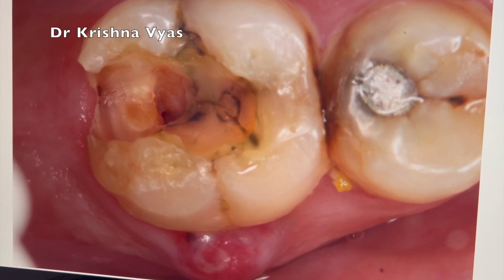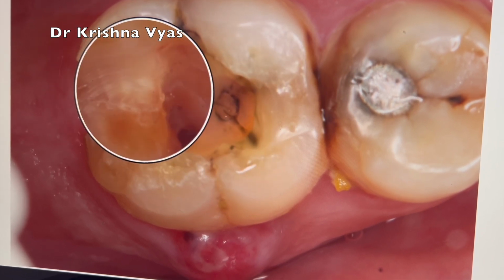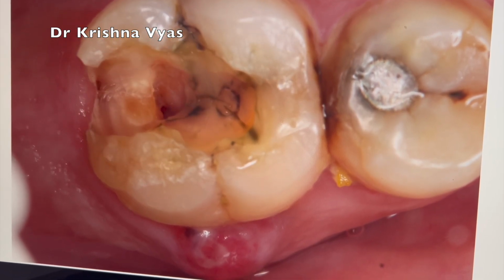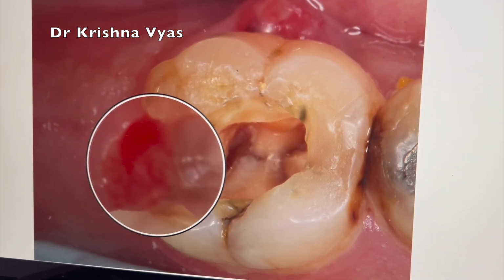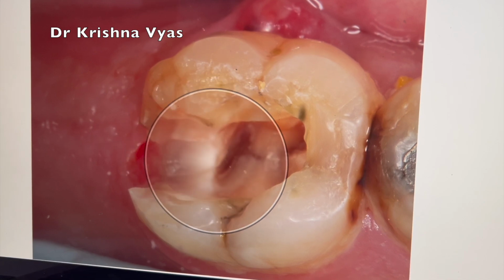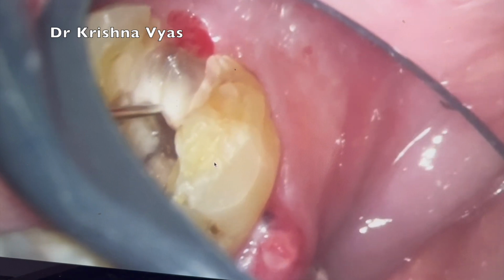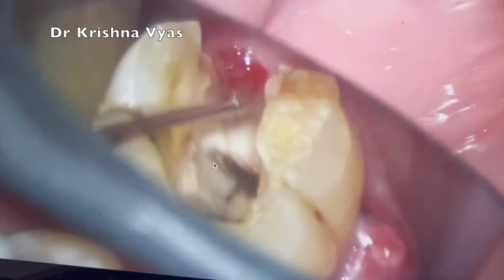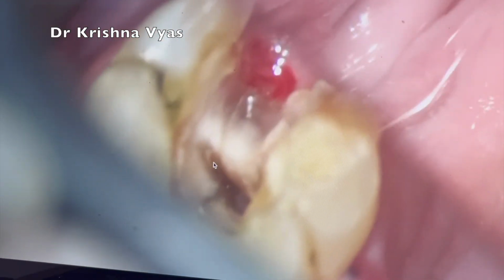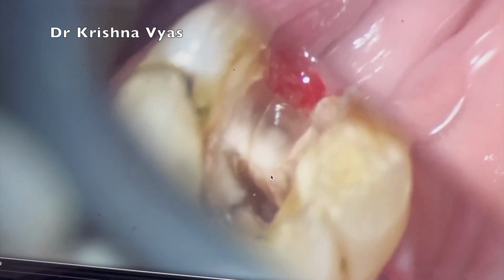So mentally I prepared the patient and then started with the caries excavation. You can see that the crack line is there, and further deep it is going. So I have gone further subgingivally, almost 2 millimeters, still the crack line is going down. So now when I check, it is going into the root portion. Since it is going into the root, we have to extract the tooth. So I showed the patient that it is propagating into the root, so it requires extraction.